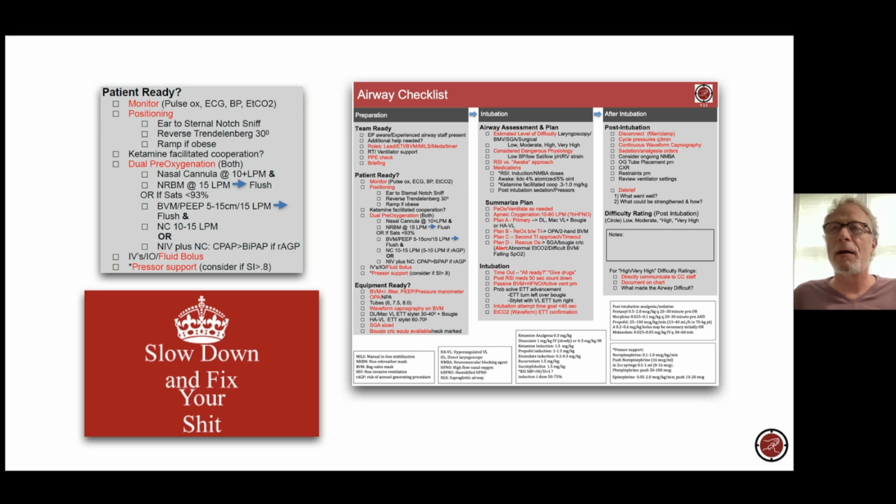We're going to position our patient, right? We're going to have the head of the bed up, and we're going to have them in sniffing, right? So ear to sternum, as we've talked about and we'll talk about and reinforce, is just an endpoint for sniffing, right? So they need to have some flexion and extension for you to facilitate laryngoscopy and intubation, right?